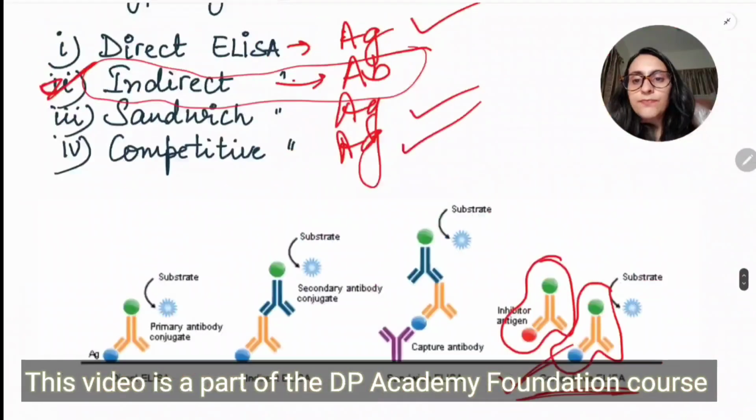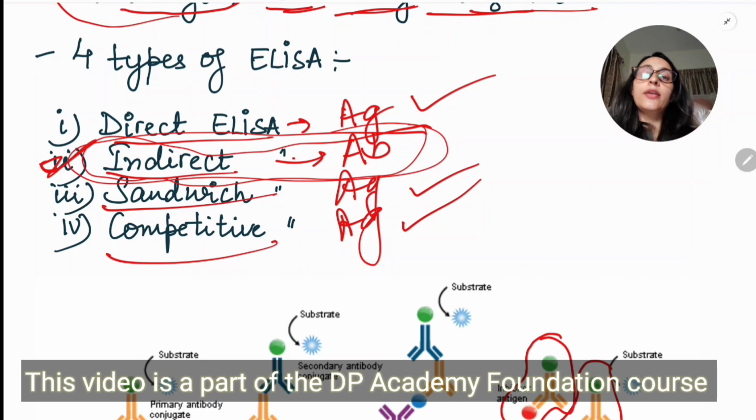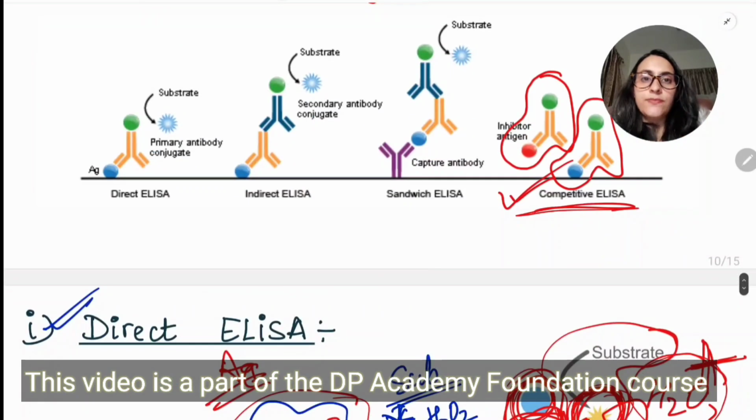See, we have studied 4 kinds of ELISA: direct ELISA, indirect ELISA, sandwich ELISA, competitive ELISA. Indirect is the one that is done for antibody detection. While on the other hand, direct, sandwich and competitive are done for antigen detection. In direct ELISA and sandwich ELISA, the color intensity is directly proportional to the antigen concentration. While on the other hand, in competitive ELISA, if more color comes, it means less antigen is present. So color is inversely proportional to the antigen detection.